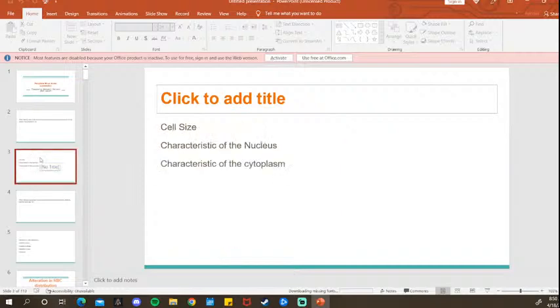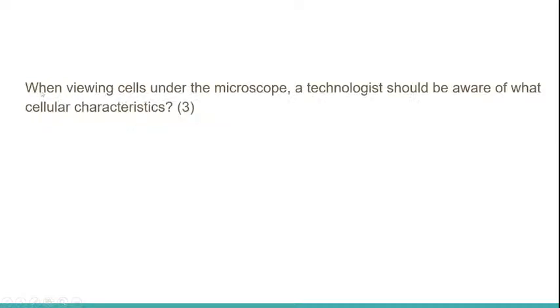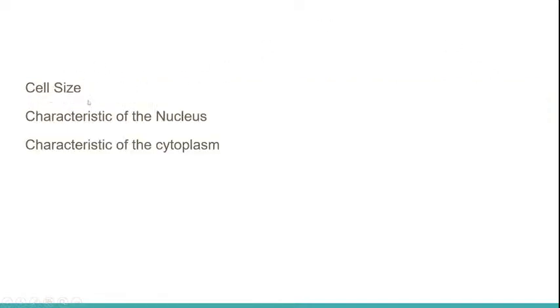As a medical technologist, what you need to look at is the cell characteristic. We're going to come back here. Sorry, I forgot to provide the hyperlink. You need to be aware of the cell size and the cytoplasm of the cell. And nucleus, when we talk about WBC anomalies, that's the time we need to take things into consideration.